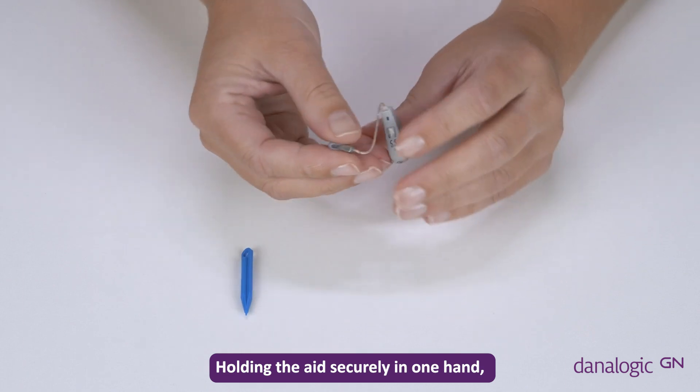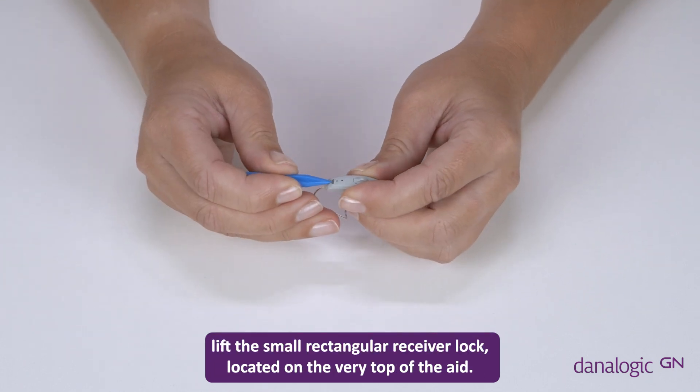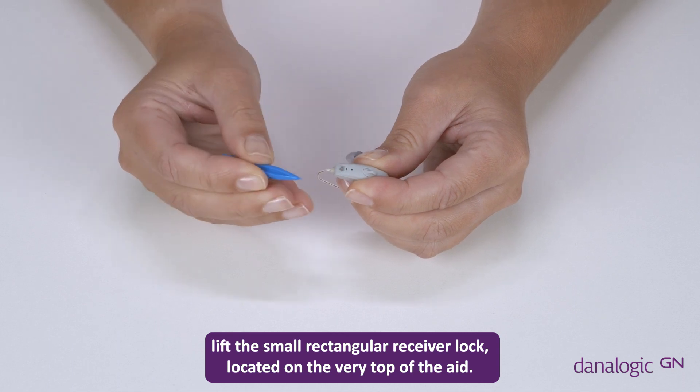Holding the aid securely in one hand, lift the small rectangular receiver lock located on the very top of the aid.